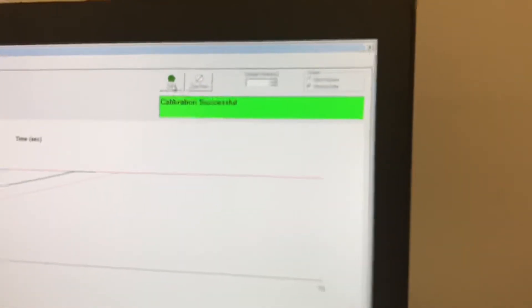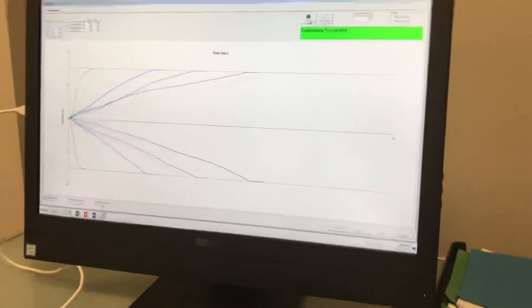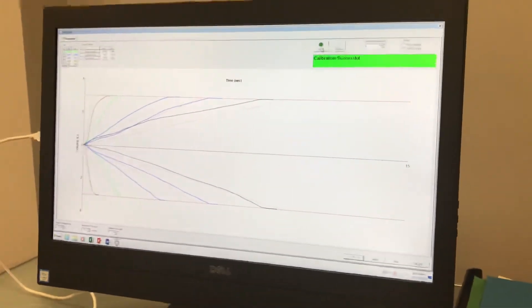And we have a successful calibration. At this point the spirometer is ready to be used.